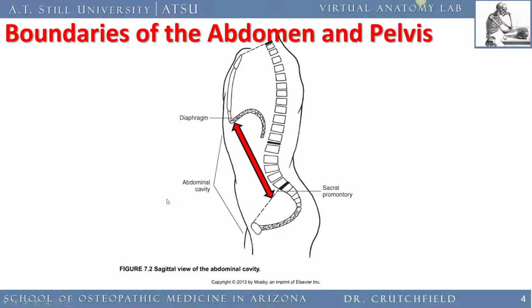So it goes without saying that there have to be some boundaries of the abdomen and pelvis when we order CT scans. If you order a CT scan in the hospital and you order just an abdomen, you will literally just get that portion that is seen here. You will get just the abdominal contents.